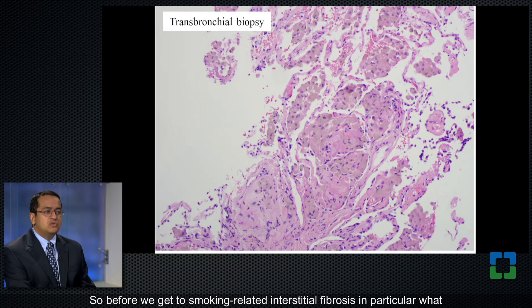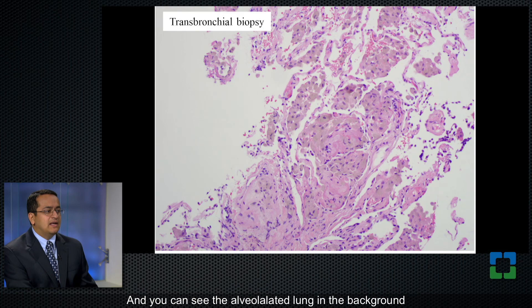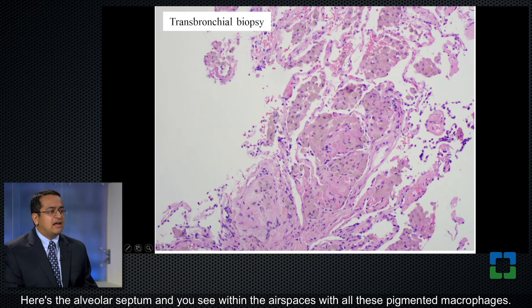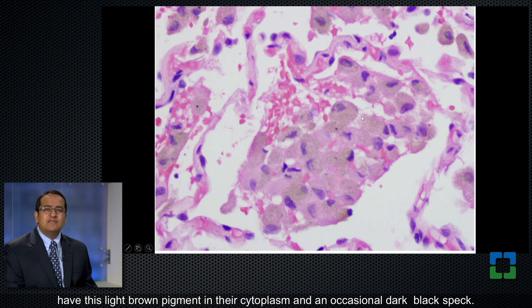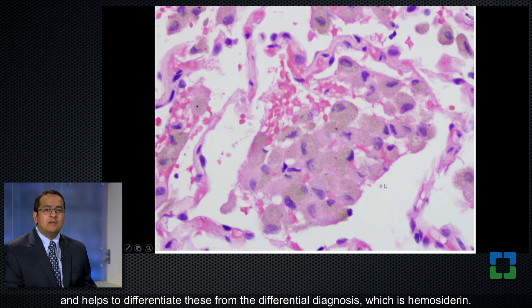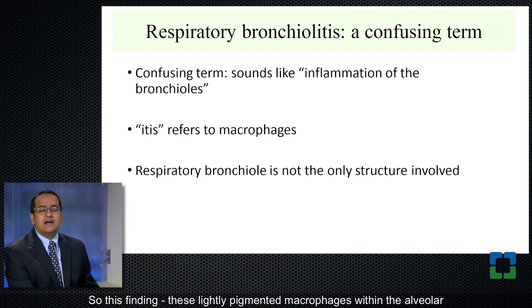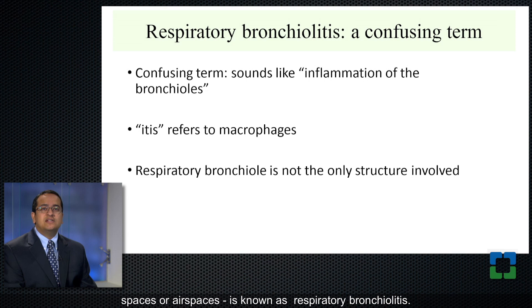Before we get to smoking-related interstitial fibrosis in particular, you should understand the concept of respiratory bronchiolitis. Here I'm showing you an image from a transbronchial biopsy. You can see the alveolated lung in the background, the alveolar septum, and within the airspaces are all these pigmented macrophages — light brown colored macrophages. At higher magnification, these macrophages have a light brown pigment in their cytoplasm and an occasional dark black speck. These findings of lightly pigmented macrophages within the alveolar spaces is known as respiratory bronchiolitis.